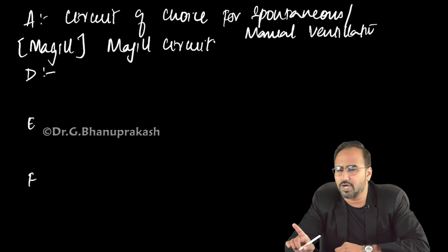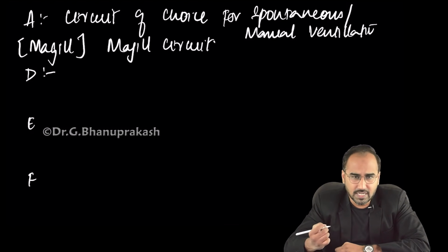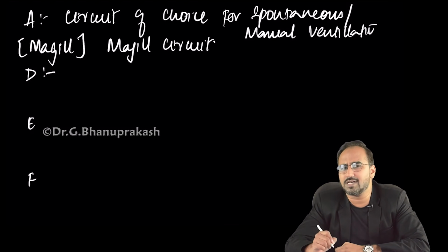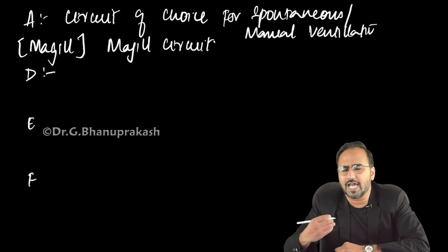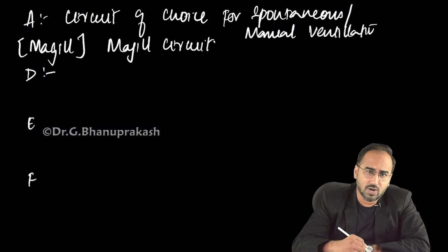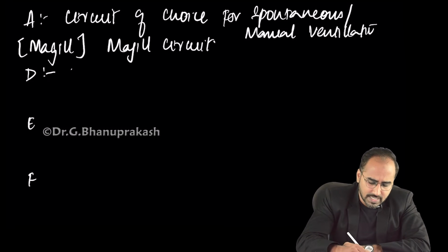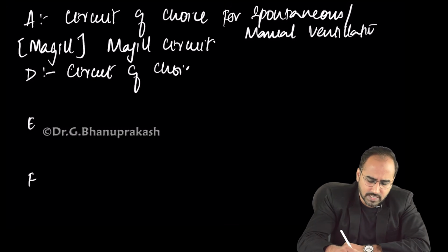Next, coming to Mapleson D circuit. B and C we are not using. Mapleson D circuit was introduced some 20 years back. Now are we having ventilators? Yes sir, we are having adequate ventilators in our hospital. So now the circuit that we are commonly using is Mapleson D circuit.